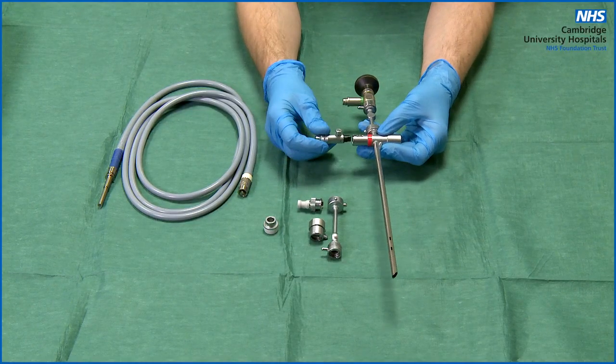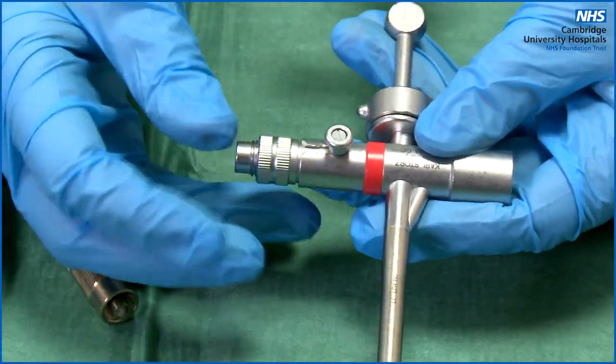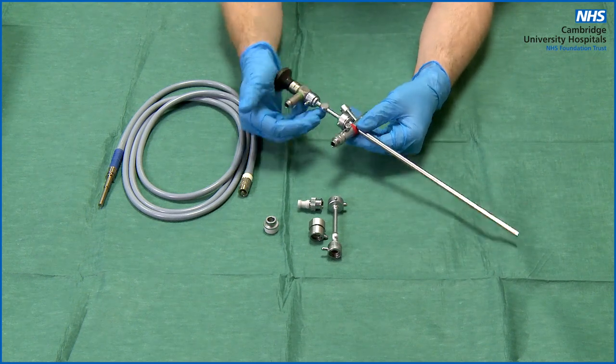Next, connect up the light prism. Simply push it on and you will hear a click when it is in place. It is possible to push it too far so that the light prism gets in the way of the telescope — simply pull it back if that happens.